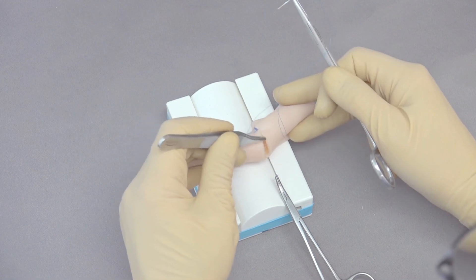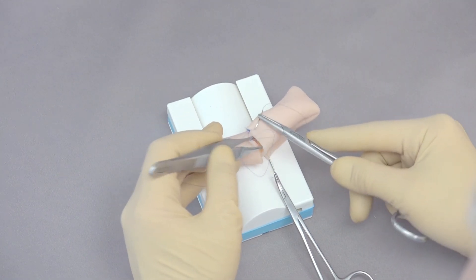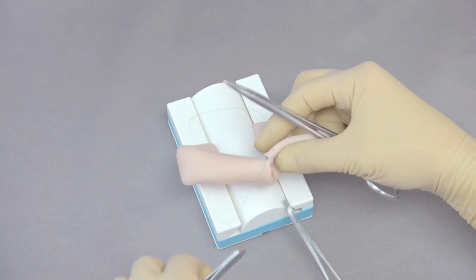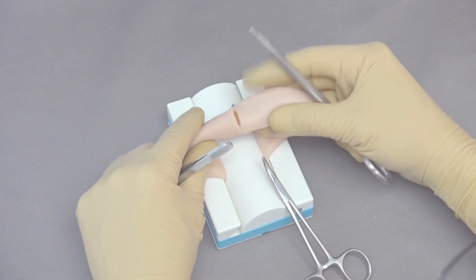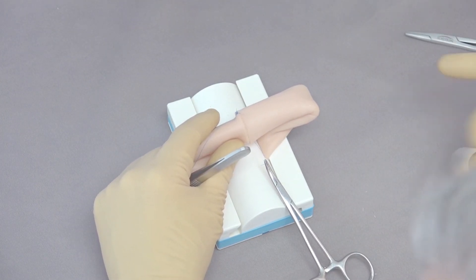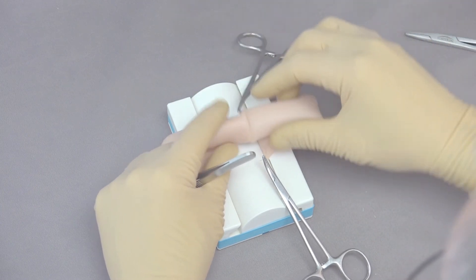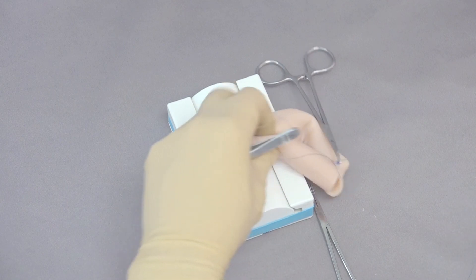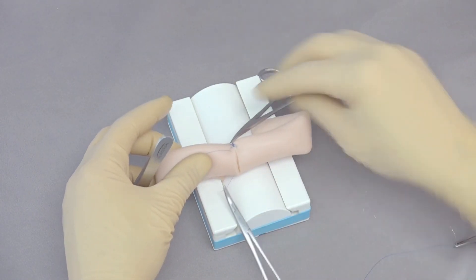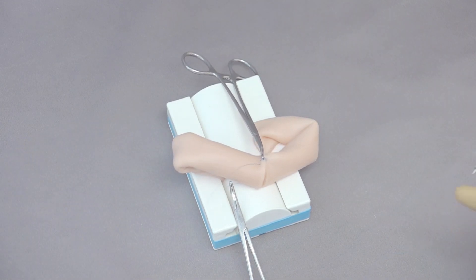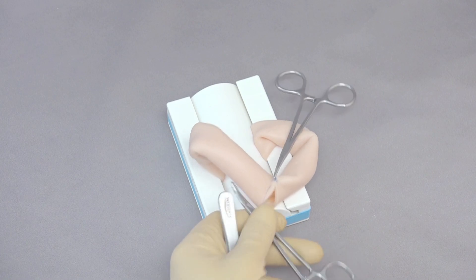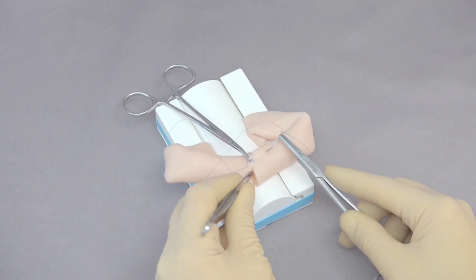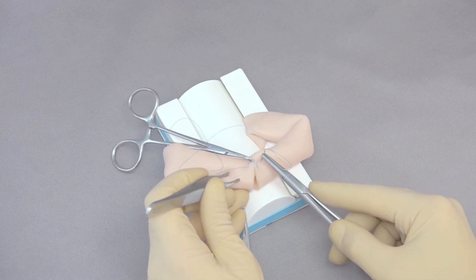Again as I start I'm going to use my thumb forceps to stabilize the bowel to make sure that I'm not getting both sides of the bowel and I can work to get both of these layers. You could in some cases if I'd left this other side long I could have put a hemostat there to help stabilize it. So in this case I can grab here and that will help to hold that in position for me a little bit better. You can see how that will hold it in the tensioning device a little bit better. This is where in surgery having an assistant makes life very simple because you can hold things together, but now you can see I've got this held and as long as I don't wrap it around my hemostats it gives me a nice stabilizing base to work with.